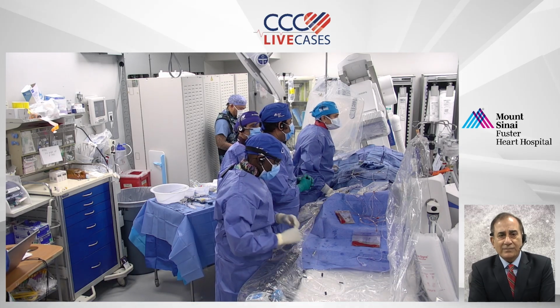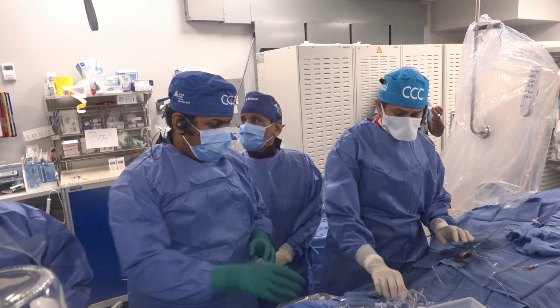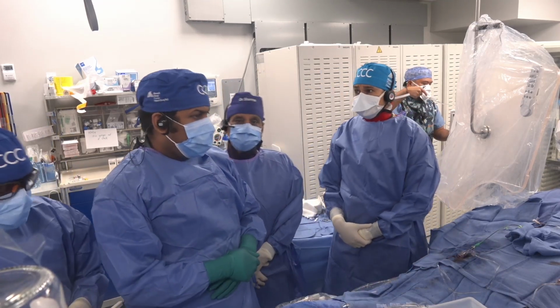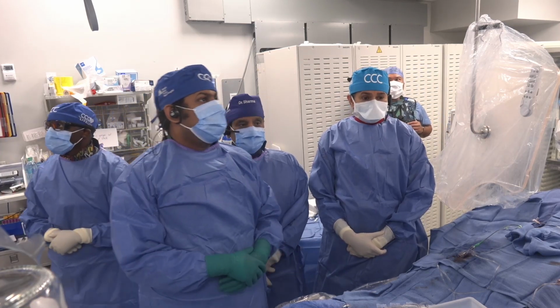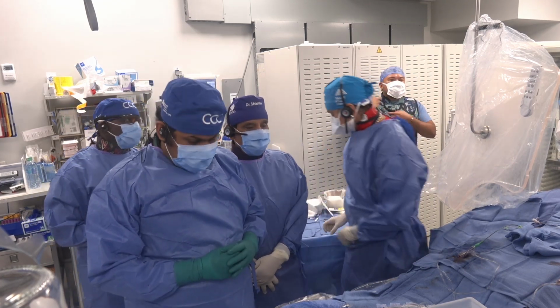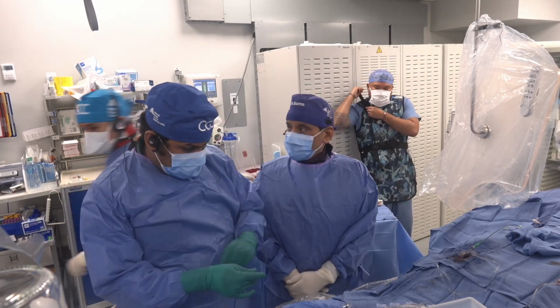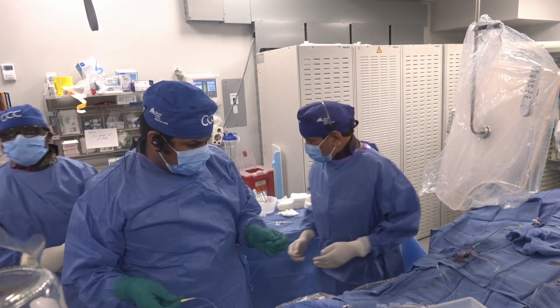Good morning, and welcome and greetings from the Cath Lab to our lively and ever-growing CCC live webcast audience. Today's case is especially complex because there is a lot of demand for CTO cases. Globally, we have taught everybody rotablation, left main, and calcific bifurcations, but they need a little more on the CTO. And this is what we are going to show today.